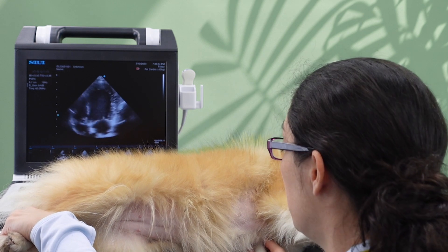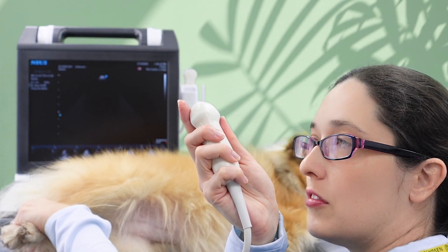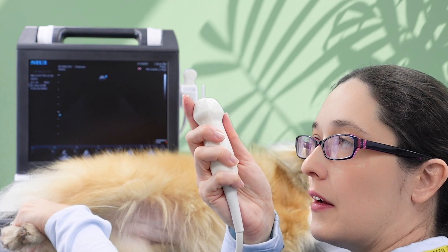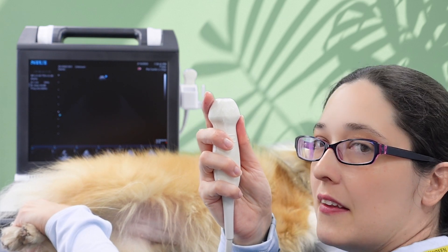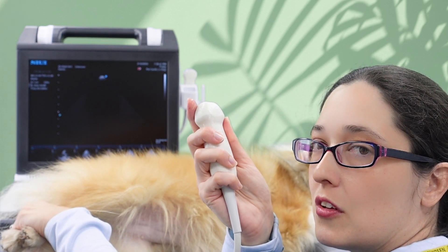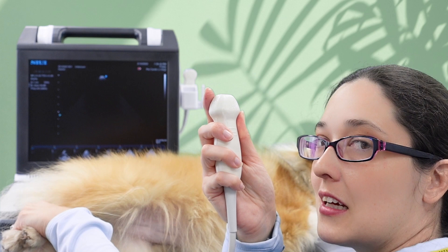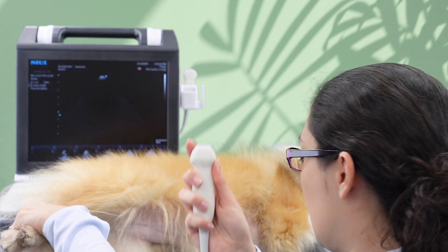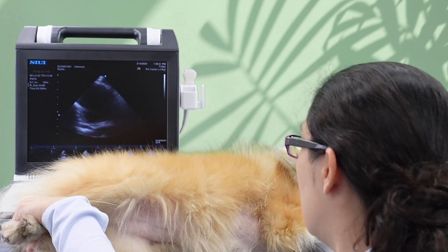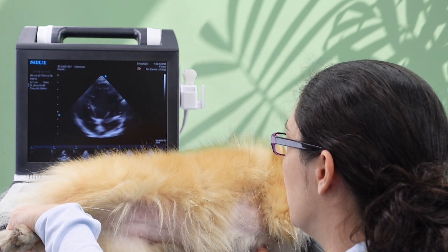It's a very small movement — tilting like that for the five-chamber and then back again this way for the four-chamber. It's a very slight rocking movement. I'm exaggerating it for the camera; in reality it's not that much of a movement at all.